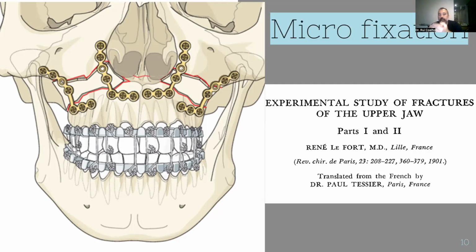So the J or L type of plates have a mechanical rationale. They are on the pillars of the face, and they also have the straight line along the occlusion force, and then an oblique or parallel line for torsion of the maxilla.